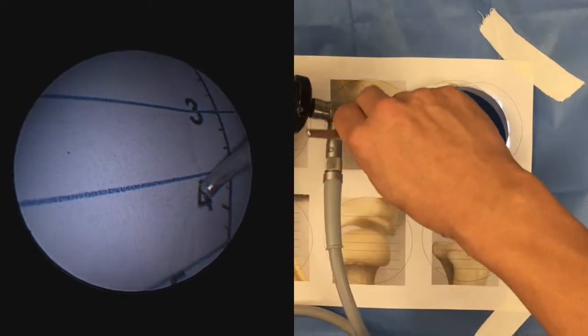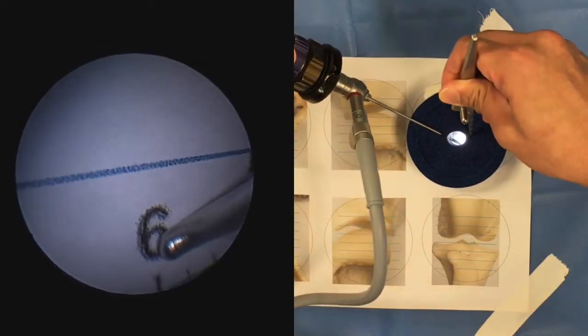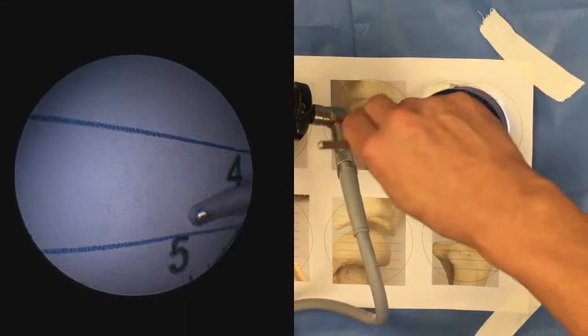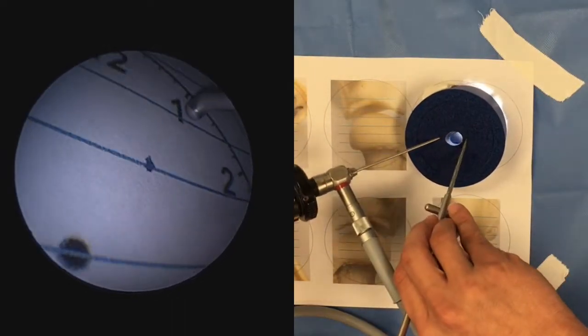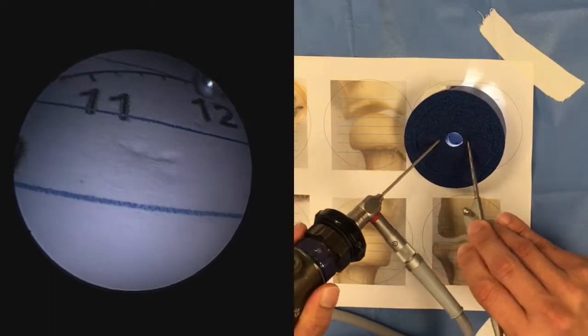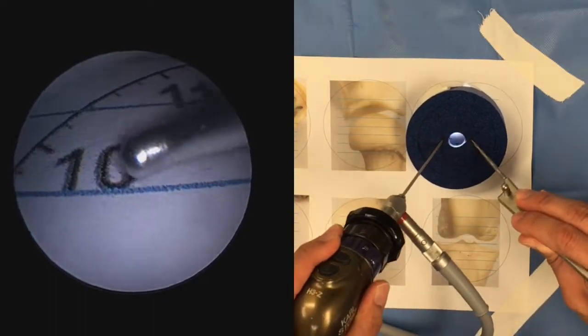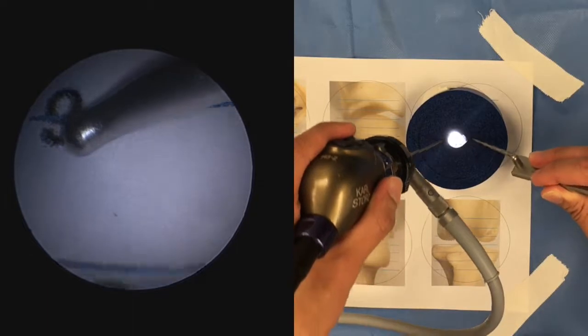Now what we would like you to do is to probe each number. This is obviously going to involve moving the arthroscope to change the field of view to find each number, and we're following the field of view with our probe tip. Remember to keep those blue lines nice and horizontal.